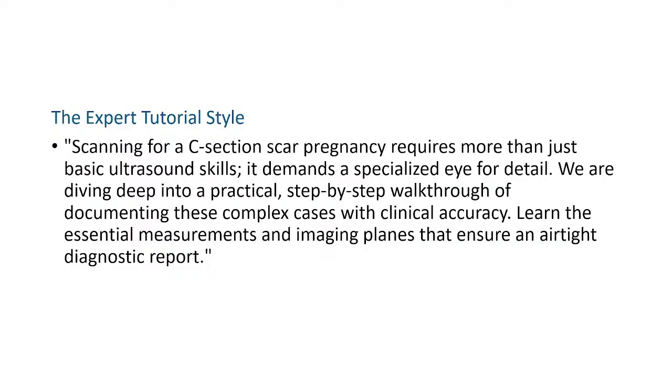We are diving deep into a practical step-by-step walkthrough of documenting these complex cases with clinical accuracy. Learn the essential measurements and imaging planes that ensure an airtight diagnostic report. When I talk about an airtight diagnostic report, we are saying a win-win situation, a don't-miss situation, where we have to make sure.